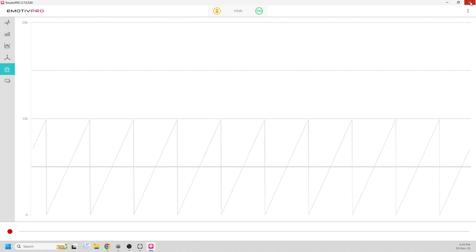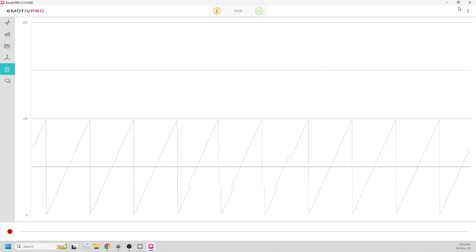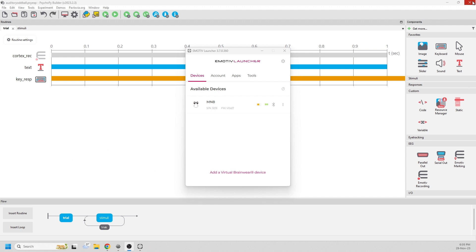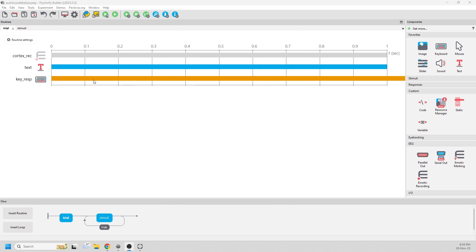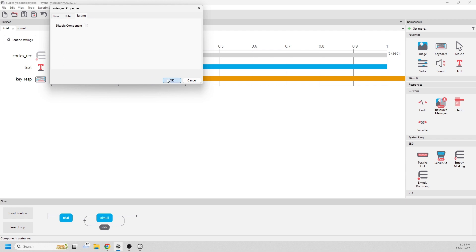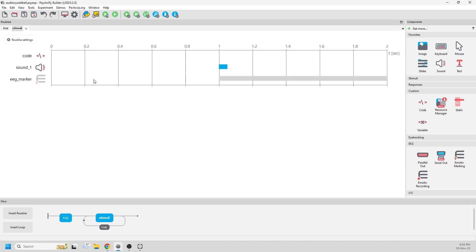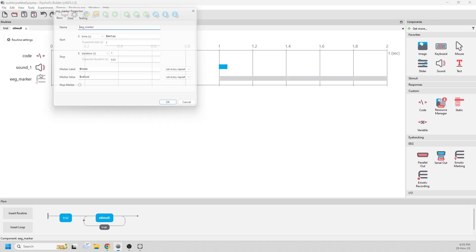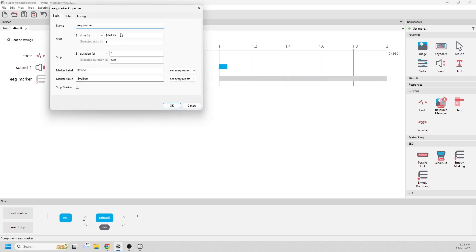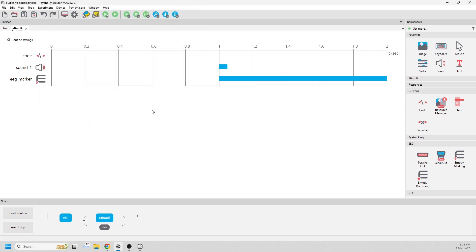Once you've checked your data, you can keep the Emotive Pro running, but you can also just close it and make sure you're connected only to your Emotive launcher. Now we're ready to run the experiment. Let's enable our components again and let's click run.